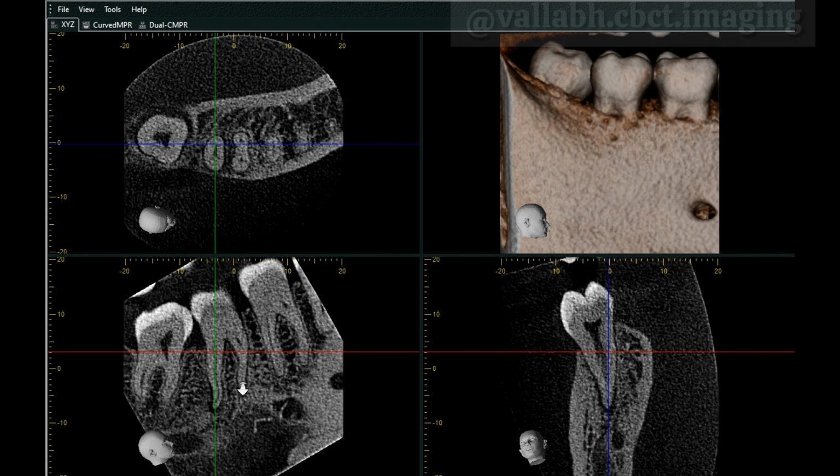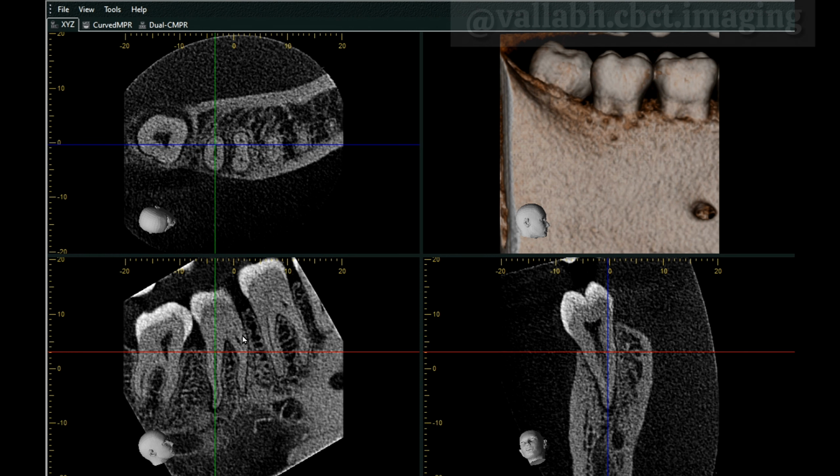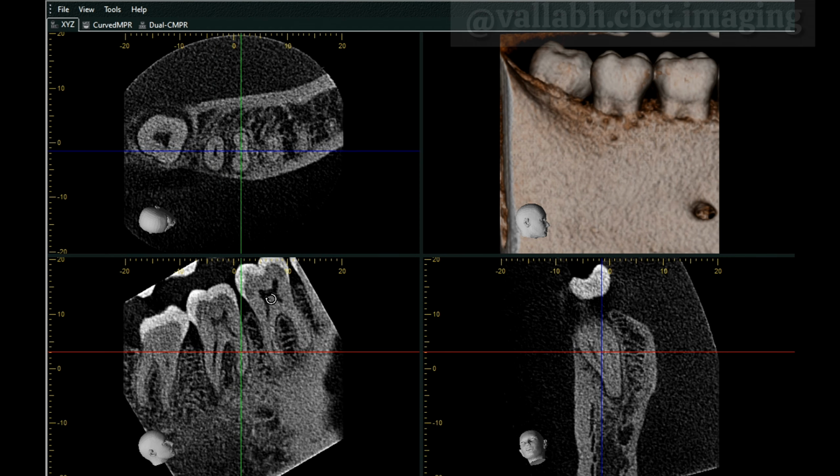We also have to evaluate for cracked tooth syndrome by making the patient use a bite block or any object just to evaluate if there's cracked tooth syndrome. Whenever the bite is released and the patient is having some kind of tooth pain, it is suggestive of a cracked tooth.